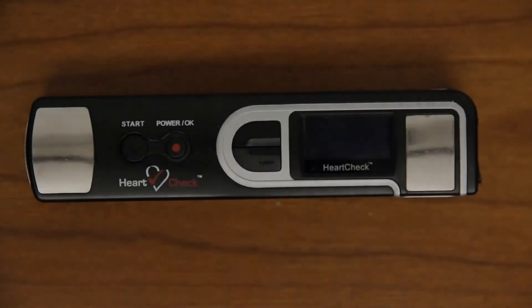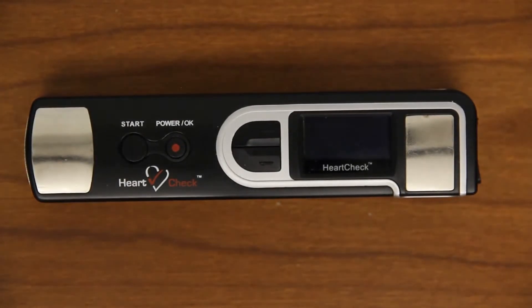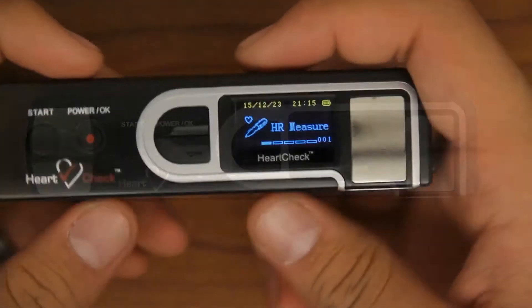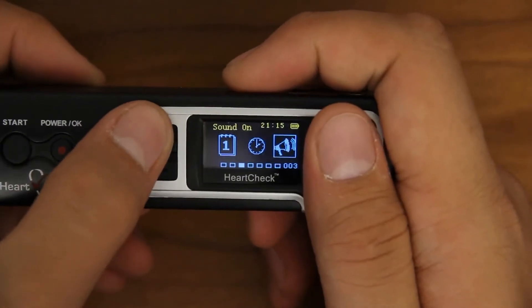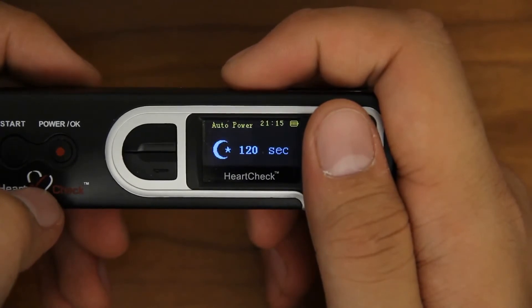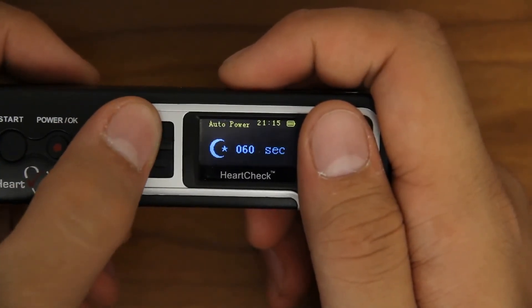Adjusting Auto Power Off. If left untouched, the hard check pen device will automatically power itself off after a given period of time. You can adjust this feature by scrolling to and selecting the Auto Power Off category located in the System Setup menu. Use the arrow keys to adjust the Auto Power Off time from 10 to 120 seconds.